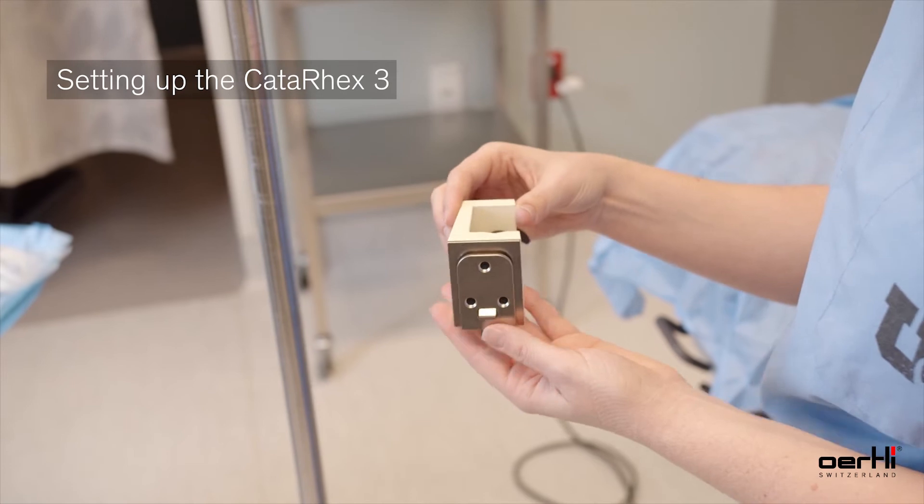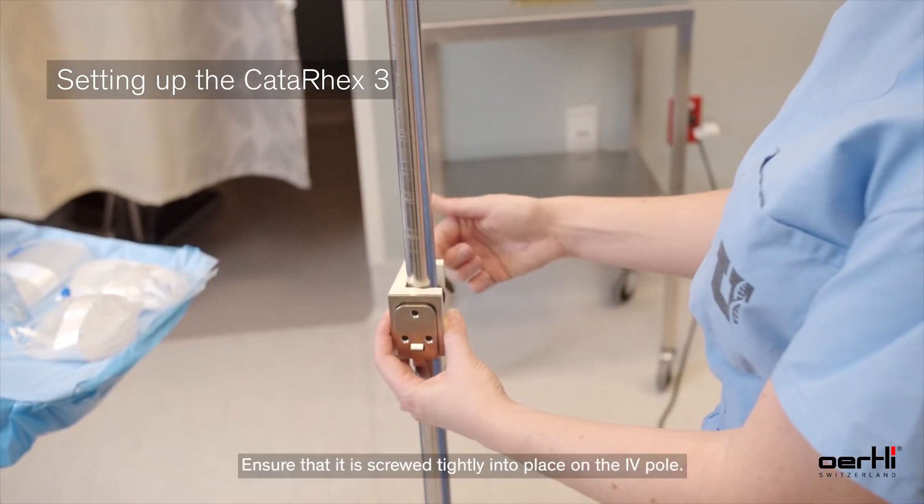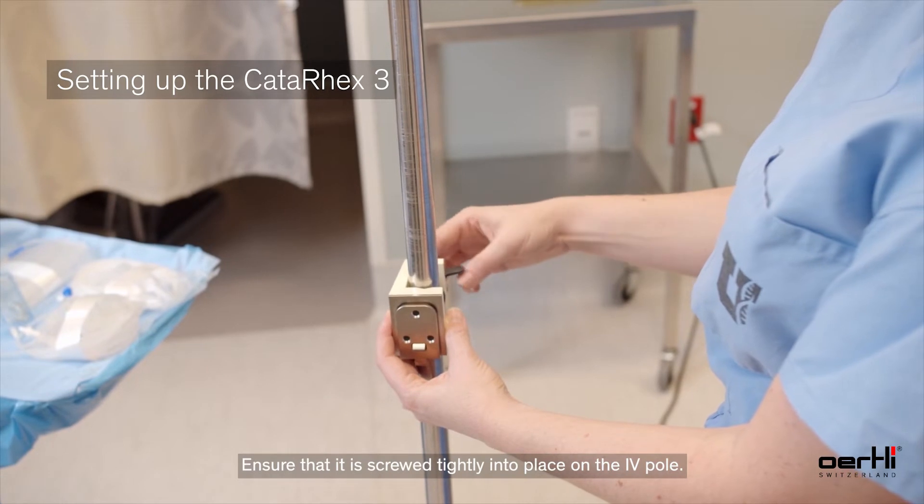To set up the device, place the locking mechanism onto the IV pole. Ensure that it is screwed tightly into place on the IV pole.